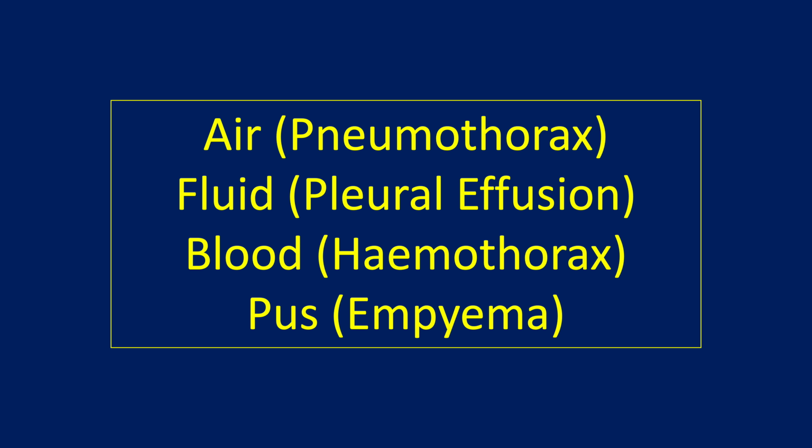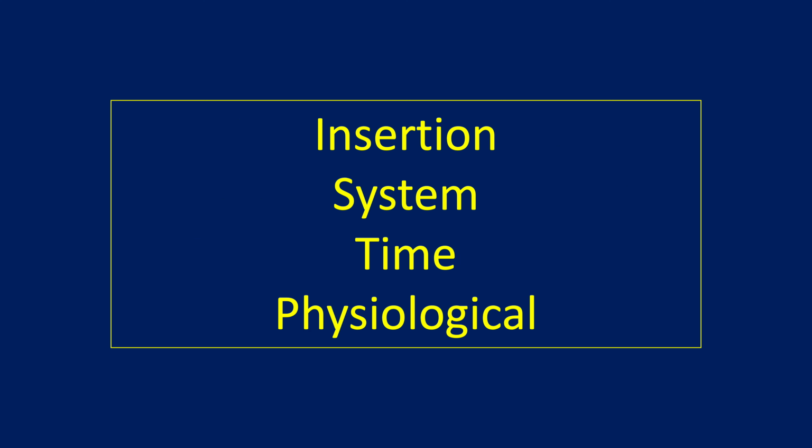As we discussed, a chest drain can remove air or fluid. The fluid could be pleural fluid, pus, blood or chyle, or the drain may be placed post-operatively following major thoracic, cardiac or gastrointestinal procedures. Insertion of an intercostal drain is usually a routine procedure. However, it is associated with complications. The National Patient Safety Agency issued a safety alert highlighting the nature of these complications, with a 12% risk of moderate harm, a 1% risk of serious harm, and also a 1% risk of death.